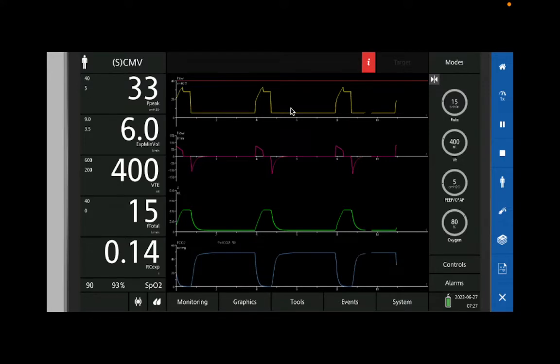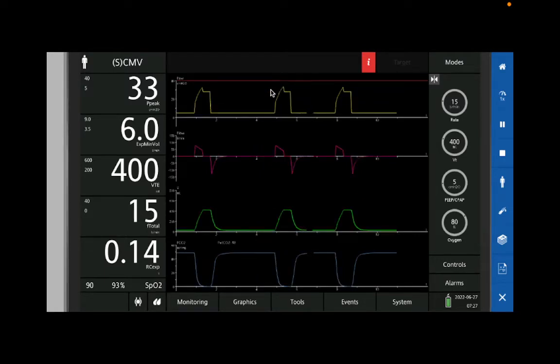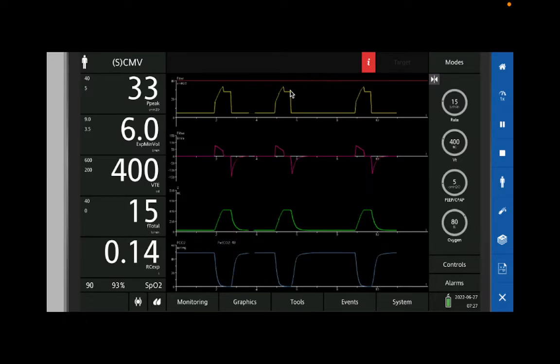What kind of things are going to increase your plateau pressure? ARDS, like we're talking about. What else? COPD doesn't, actually. COPD lungs just turn into like big floppy bags, so it doesn't change the pressure. Interstitial lung diseases, yes.